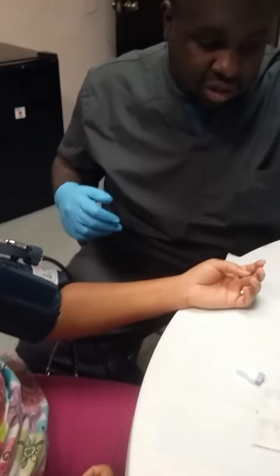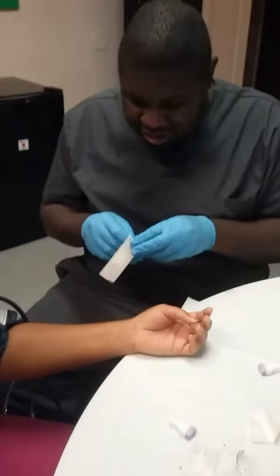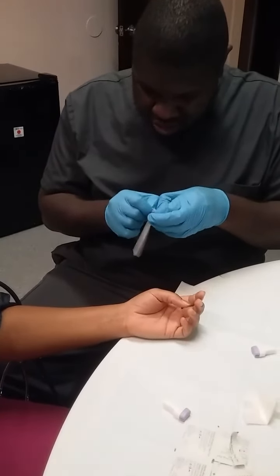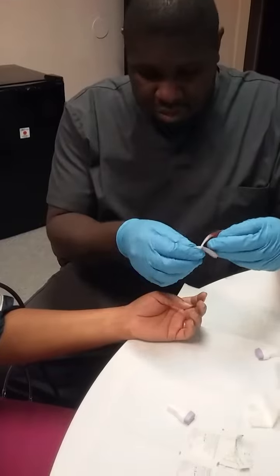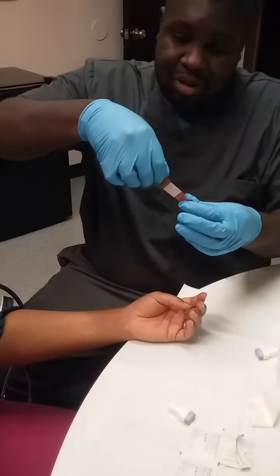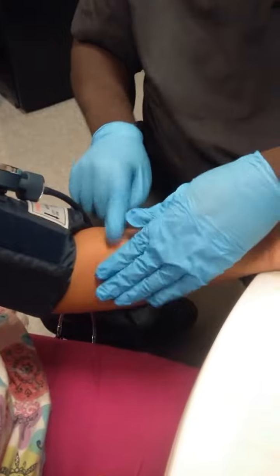Now she's finished bleeding. We take our bandage. You can use gauze. You can use cotton or gauze if you need. And we apply the bandage to the incision site.